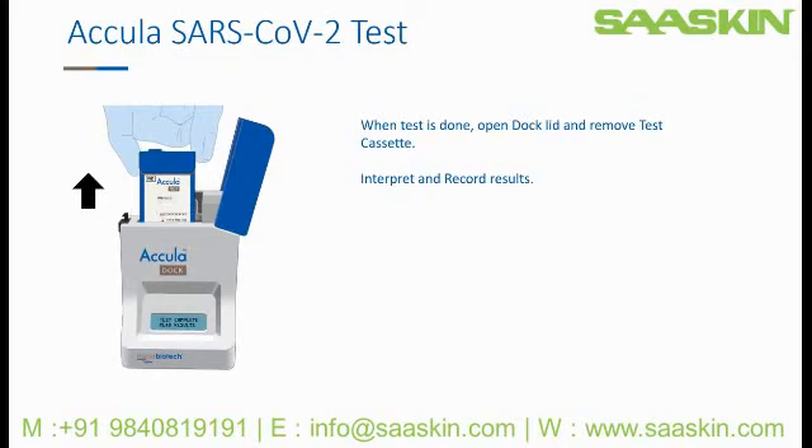Upon completion, the dock screen will read: test complete, read results. Open the dock lid and remove the test cassette. Interpret and record the results. We will review how to interpret results in the next training video. You should discard the test cassette into a biohazard container once results are recorded.